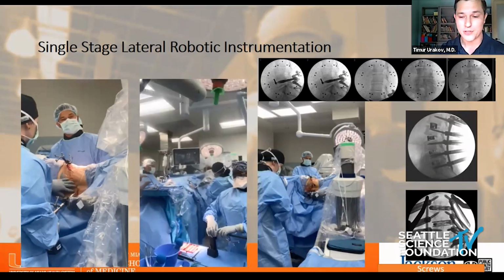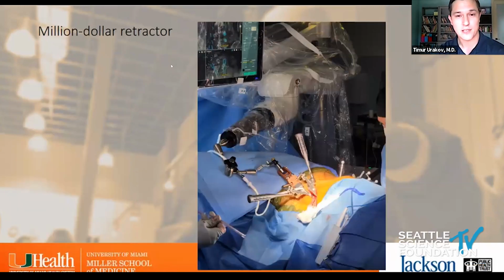One thing I would recommend, Martin, is to look first and see what you can do with that arm once you're done with the screws. Here you can see we actually keep putting it to work. I call it the $1 million retractor. It was nice to see Globus and Pantheon come together and allow me to connect the two. So now the arm is holding the retractor system once the screws are done. And that arm is pretty rigid. It's built to be stable in place and no one can really move it.